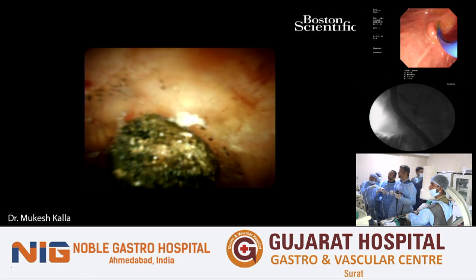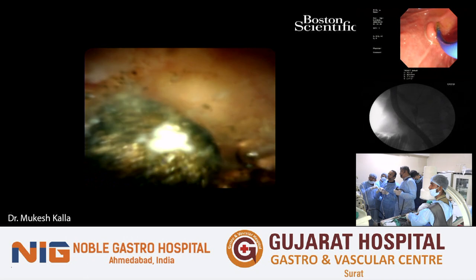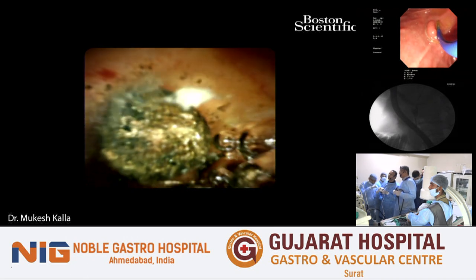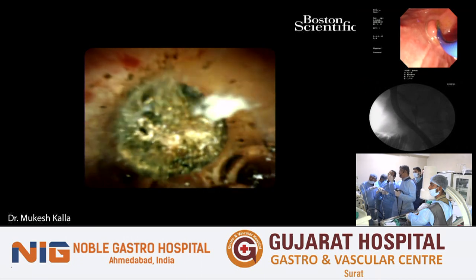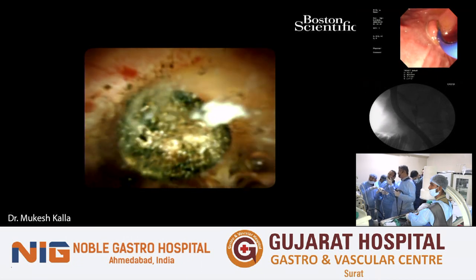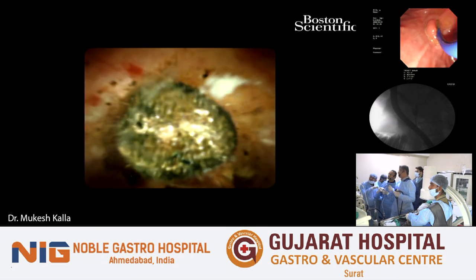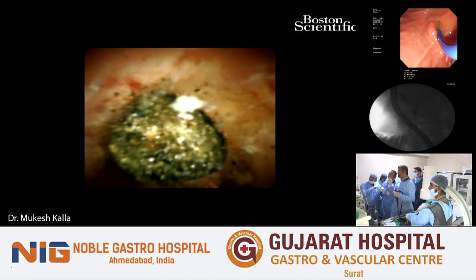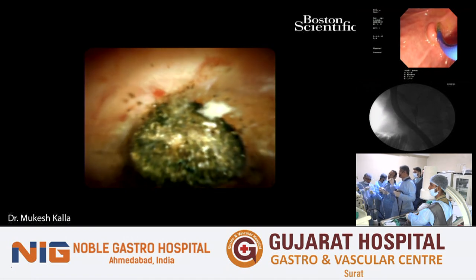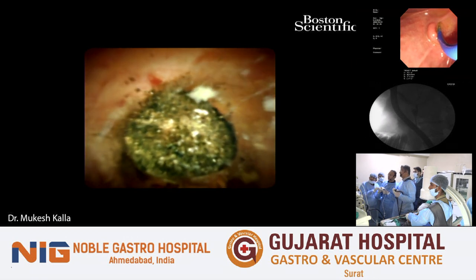Why didn't this stone come out by itself? I think it was floating, and I'm told that Yogesh had done a procedure a few days back. That time he had placed a stent. It is quite possible that this stone had migrated at that time, or maybe now because of the suction. But before we come out, after removing this stone, we will go into the cystic duct and ensure that there is no other stone remaining.